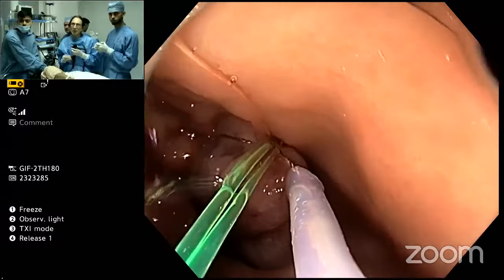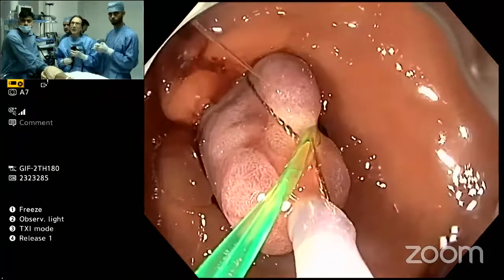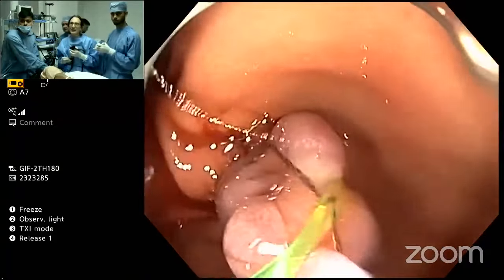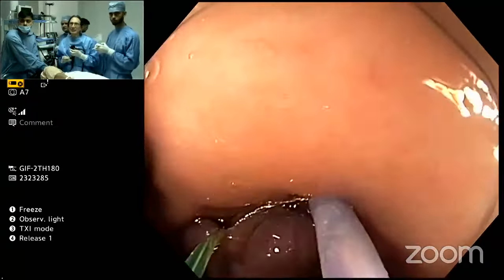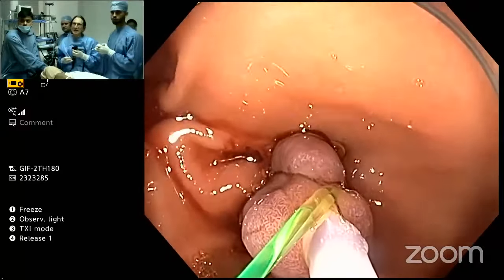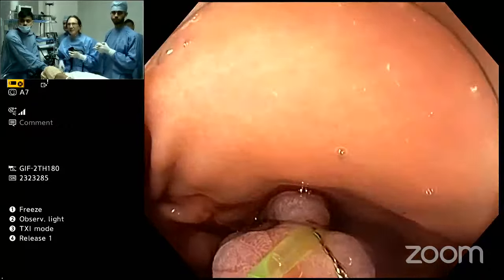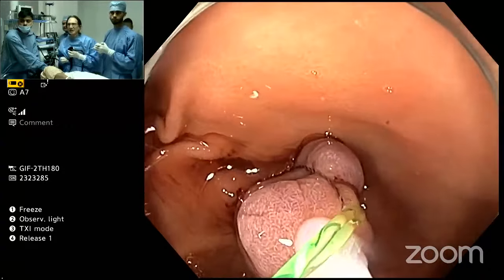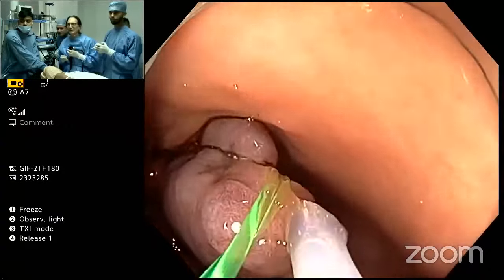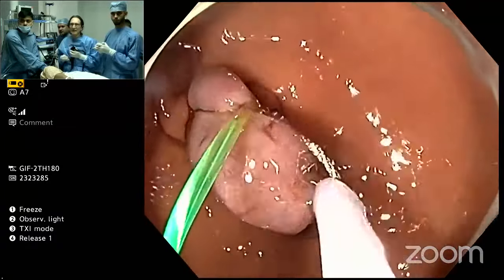So this is where you want to make sure that your snare is right above the loop. And so this is why I like having a little bit of traction there so I can kind of test to see. Do you see that the snare is not completely over the left side at the top? So I can see, is the snare all the way open still for me? Open? Yeah, fully open, yeah. Let me see here. Open.